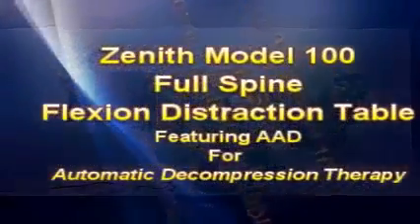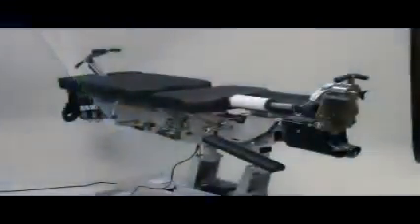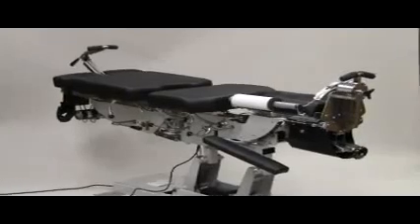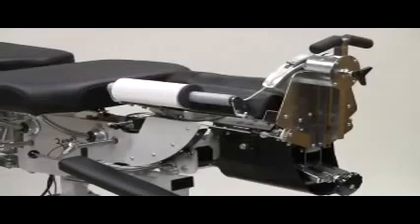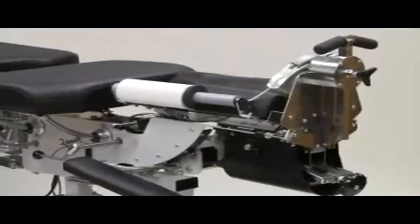Doctors, we're excited to present to you the Zenith Model 100 Full Spine Flexion Distraction Adjusting Table. This is a table that provides for the widest range of patient needs and treatment protocols. Included in standard features are a 5-year limited parts warranty, our exclusive cervical distraction headpiece with cervical flexion, extension, lateral flexion, pivotal rotation, and a cervical assist handle.